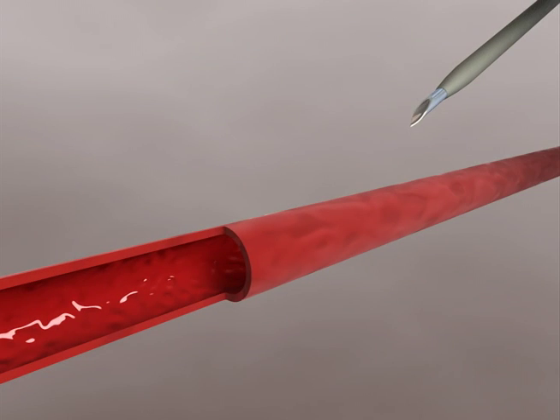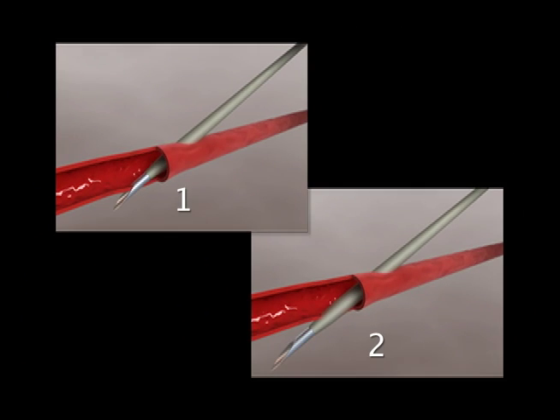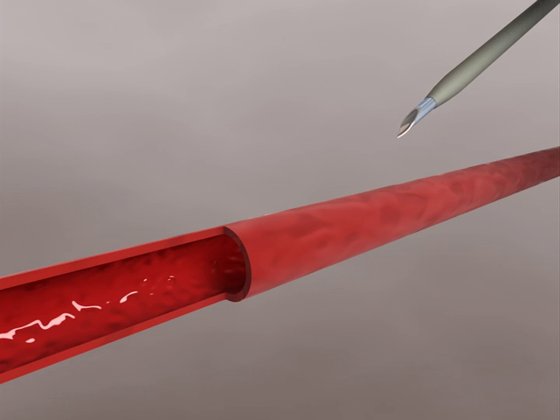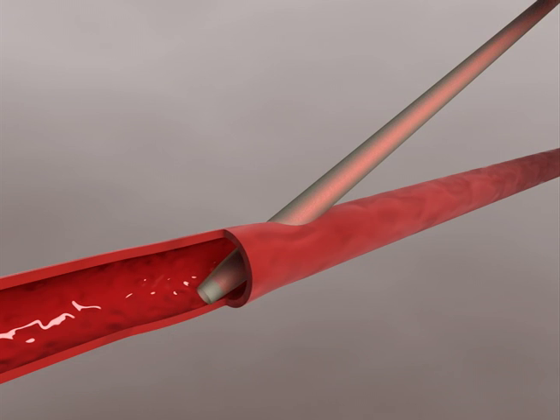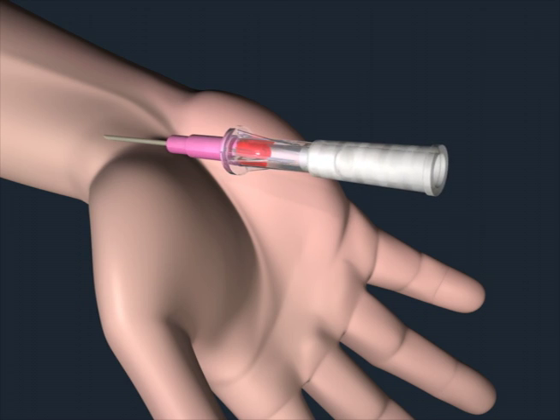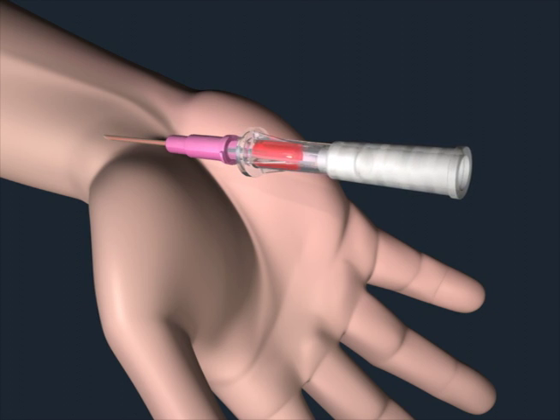The next set of issues occurs when the catheter is advanced too far after the initial flash. In the first case, only the needle tip has punctured the arterial back wall, and flow into the flash chamber will stop. If this happens, the catheter is kept in place and the needle is withdrawn a few millimeters so that its tip is now within the catheter. Since the catheter tip is still within the artery, a sleeve of blood will form and flow into the flash chamber will resume. The catheter is then carefully advanced while continuous flow is observed.